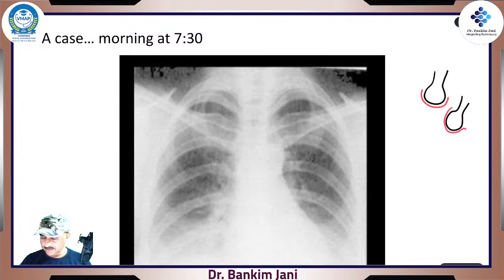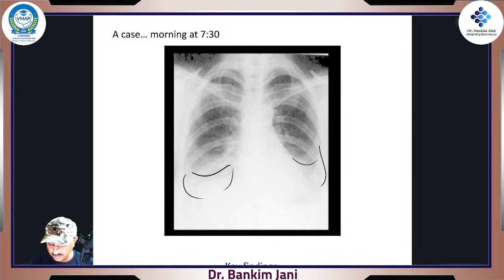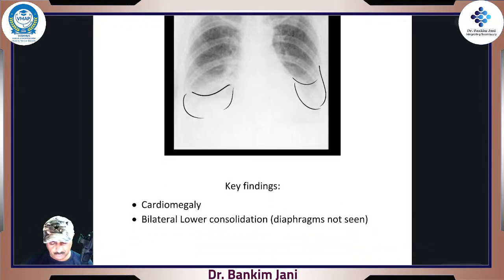Now here is the case, right? This is morning, still the senior residents have not arrived. A patient comes, and this patient is subjected to an X-ray because he came for a health certificate. An athlete, right? X-ray is taken and immediately he said, no boss, we cannot give you a fitness certificate because your lungs are consolidated, right? See over here, so much consolidation. He said, chances are very high that you have got some infection.